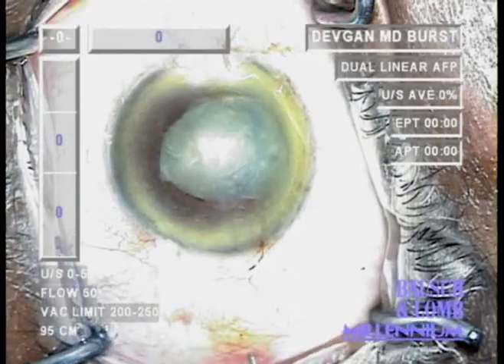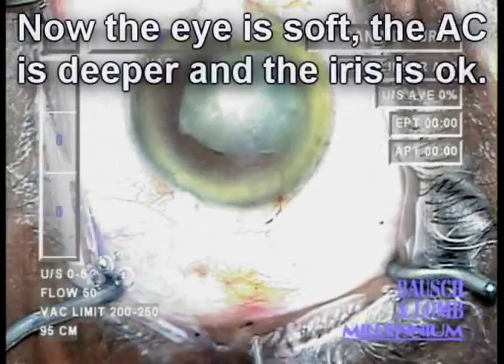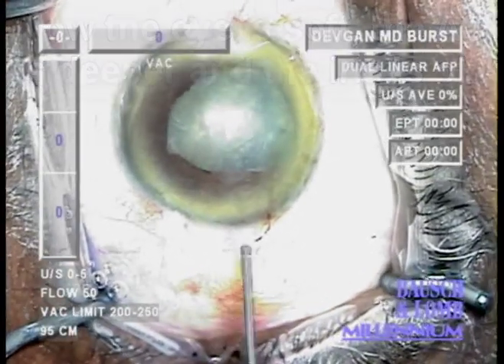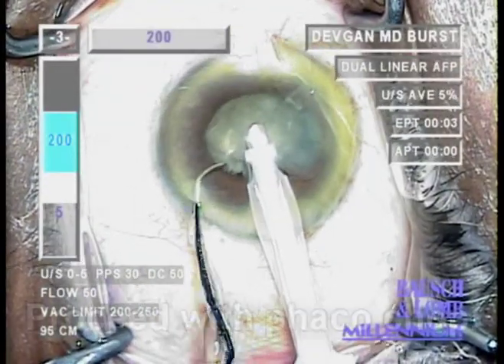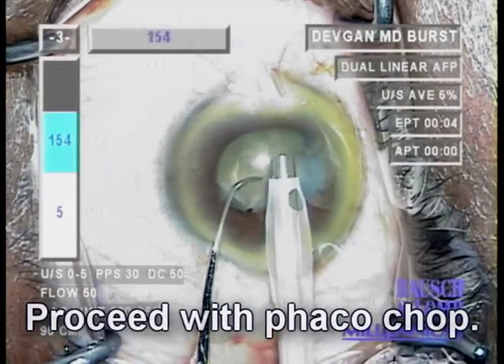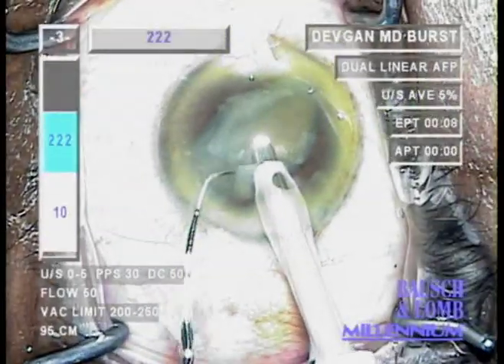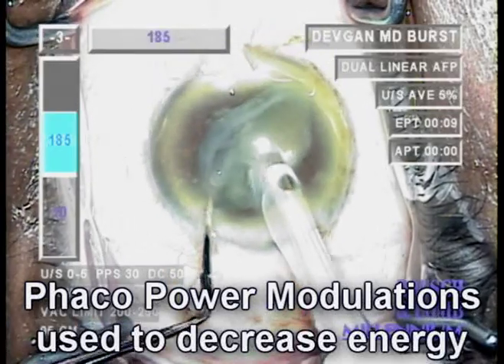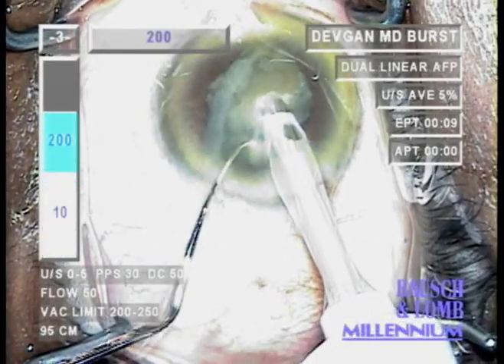Notice we'll now check the pressure and the eye is relatively soft. The patient is quite comfortable. It's easy at this point to keep the iris within the eye. We'll go ahead and proceed with phaco emulsification. In this patient, we're using relatively low power settings given the nature of her weak endothelium. Lots of phaco chop is required to mechanically disassemble the nucleus. You'll notice here the tough, leathery feel of this nucleus.